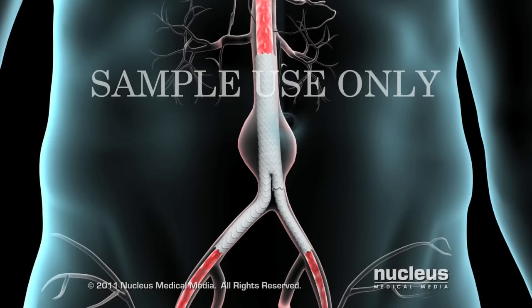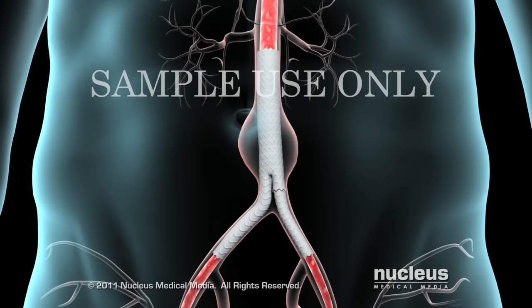Once the graft is in place, your blood will flow through it, not into the surrounding aneurysm sac, which will remove the pressure from your aneurysm.